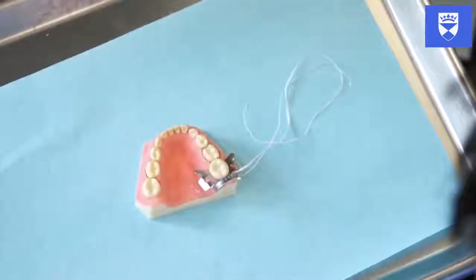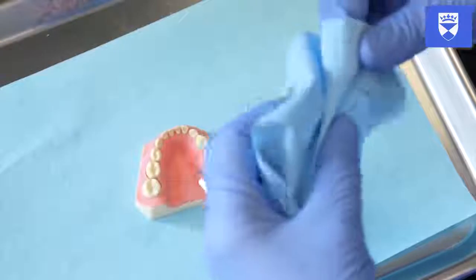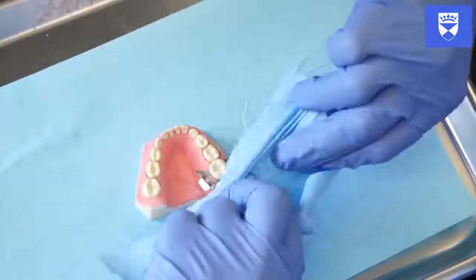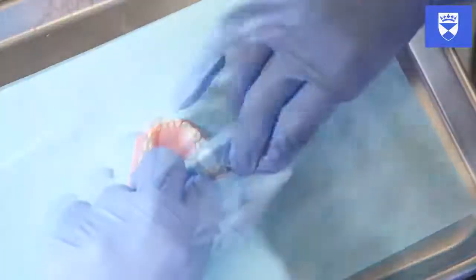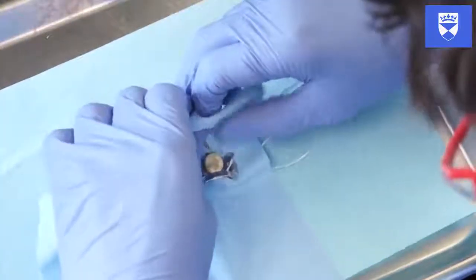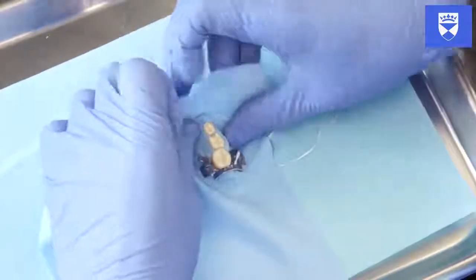Punch the appropriate holes in the rubber dam. For this exercise, this will be the tooth undergoing the pulpotomy and those immediately adjacent to it. There are many techniques for rubber dam placement. For ease, a split dam technique can be used. For this, the interproximal dam between adjacent holes is cut. This is particularly useful if the tooth is to be restored with a preformed metal crown. This will be demonstrated in your practical.